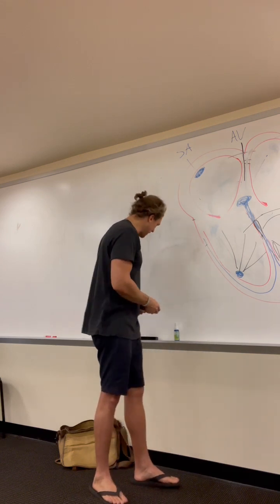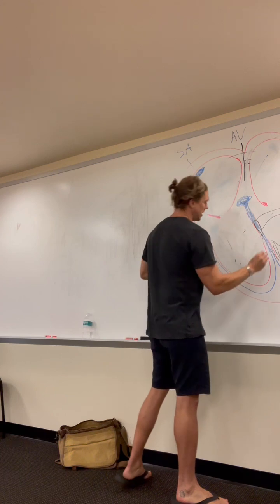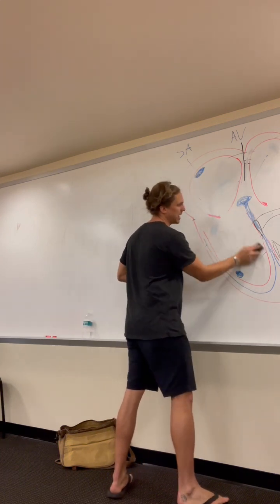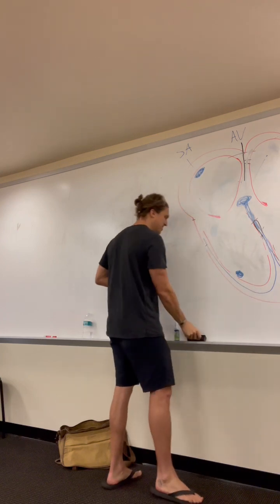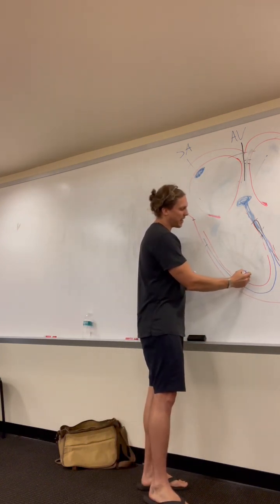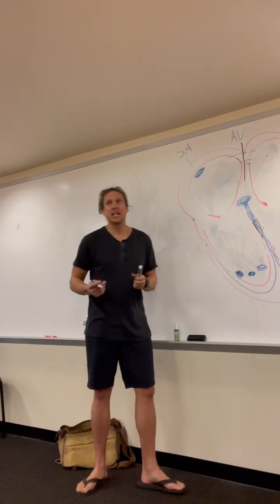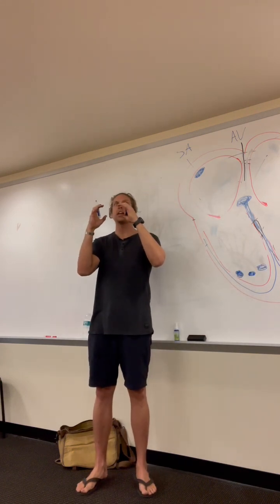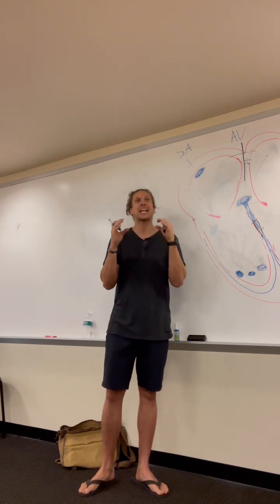So instead of it just being one focus that's irritated and has started taking over pacing, this one's gonna beat, and then the next one next to it beats, and then this one beats, but they go in order. It's not like a-fib, where it's fibrillation; we're not talking about ventricular fibrillation, we're talking about ventricular tachycardia, okay?